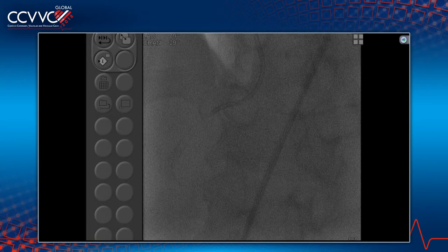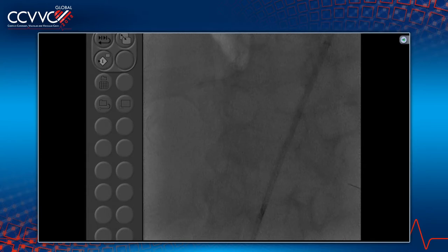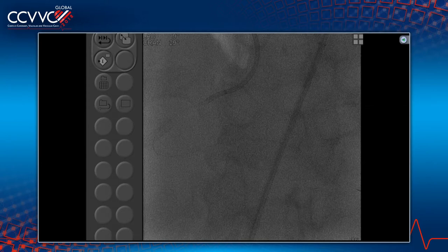Dr. Patelio, any comment thus far in the way the case goes? And would you think the imaging adjunct would have a role? I think imaging is very good because of the reason they just commented about, the sizing of a chronic occlusion. And I would just consider not treating the distal PDA because of a small vessel and a focal lesion in the end. So actually, if anything, the stent's kind of working okay in this patient. It's the area that was not stented that went down and caused the chronic total occlusion.